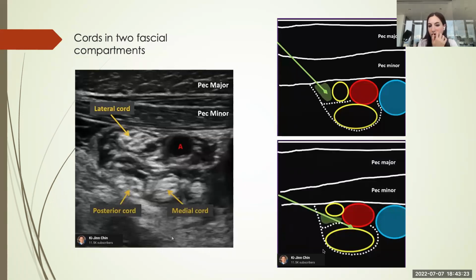The total target volume would be about 20 to 30 cc's. Again, we would deposit about 2/3 of that here and then withdraw the needle, aiming to have it just beside the lateral cord and deposit the rest of the local anesthetic there. So you are depositing local anesthetic into two different compartments, but you are technically able to achieve it with one pass.